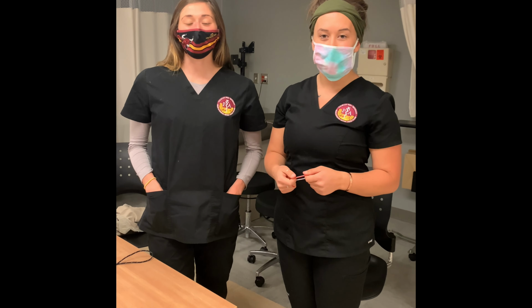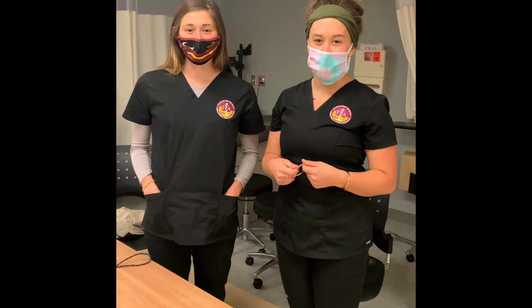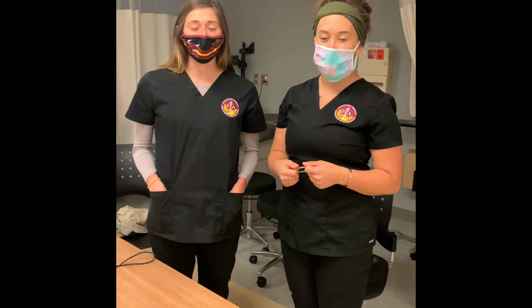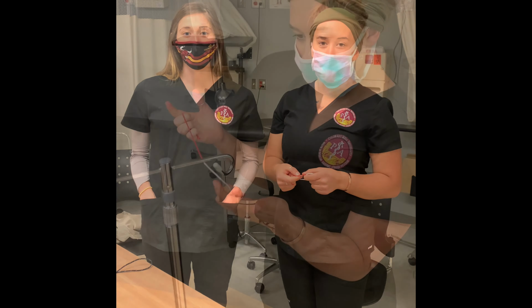Hi, my name is Kate Smith and I'm a PA student at CMU. Hi, my name is Emily Olpet and I'm also a PA student at CMU. And today we're going to discuss and explain how to perform a double-handed knot.